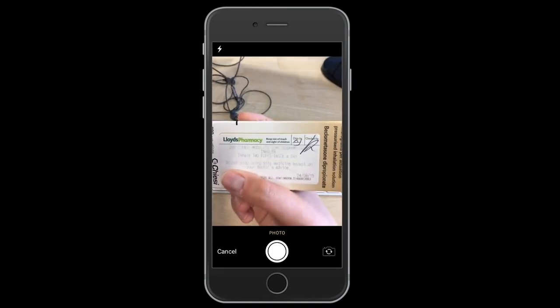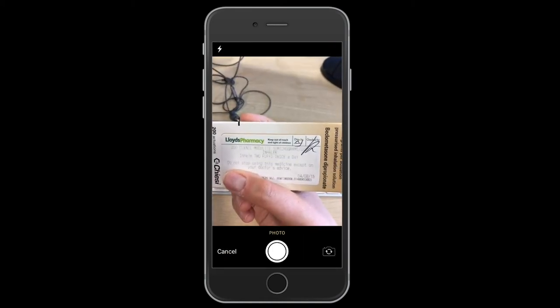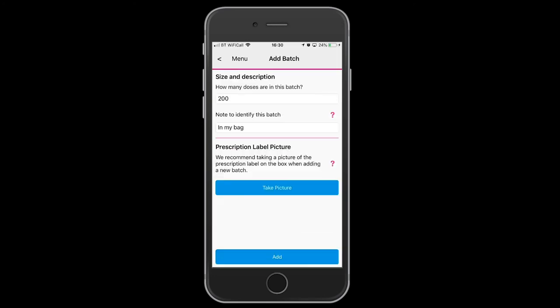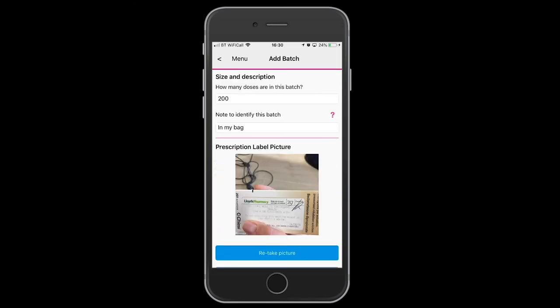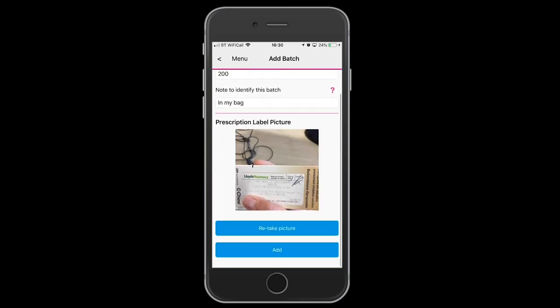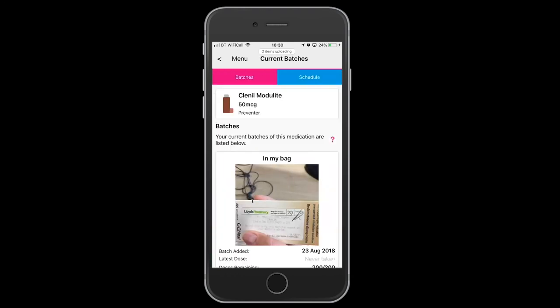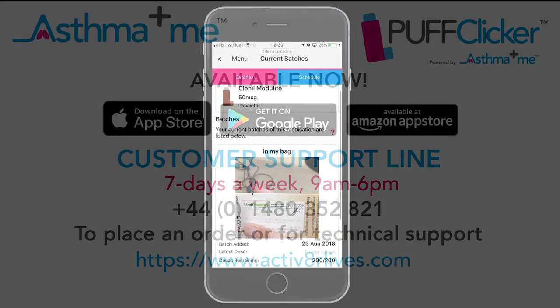We suggest you take a photograph of the prescription label, which has all of your dosage information on it. Simply click a photo, then use the photo or retake it. Add, and that will now be added to your dashboard.